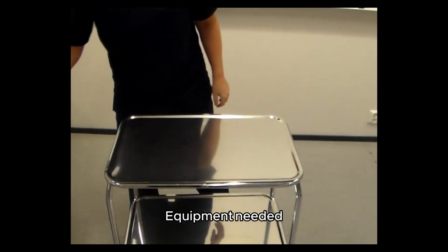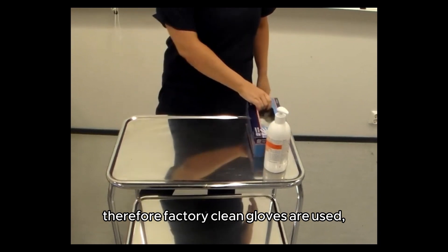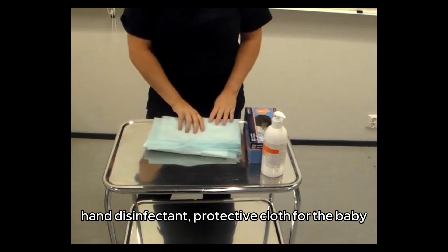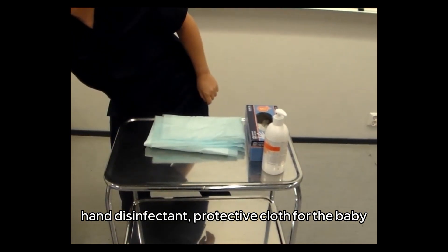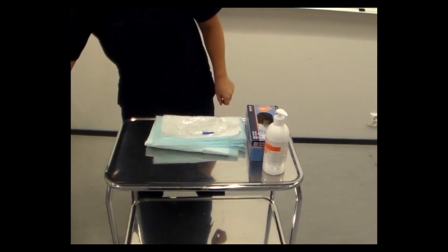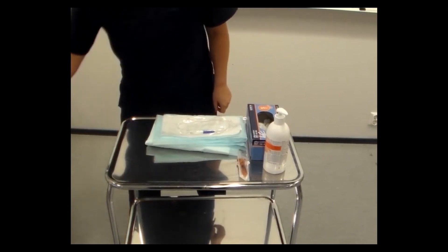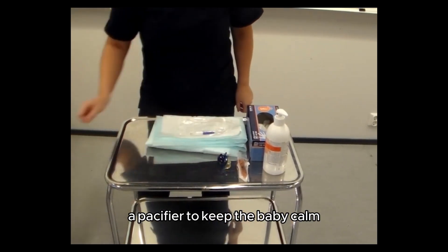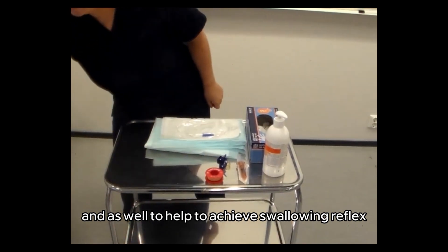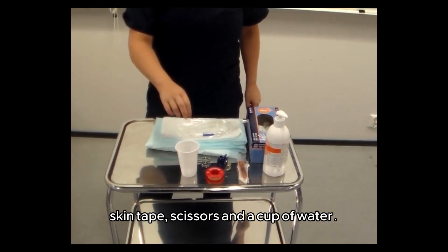Equipment needed: This is not a sterile procedure, therefore factory clean gloves are used. Hand disinfectant, protective cloth for the baby, a nasogastric tube size 6, liquid glucose in an oral syringe, a pacifier to keep the baby calm and to help achieve the swallowing reflex, skin tape, scissors, and a cup of water.